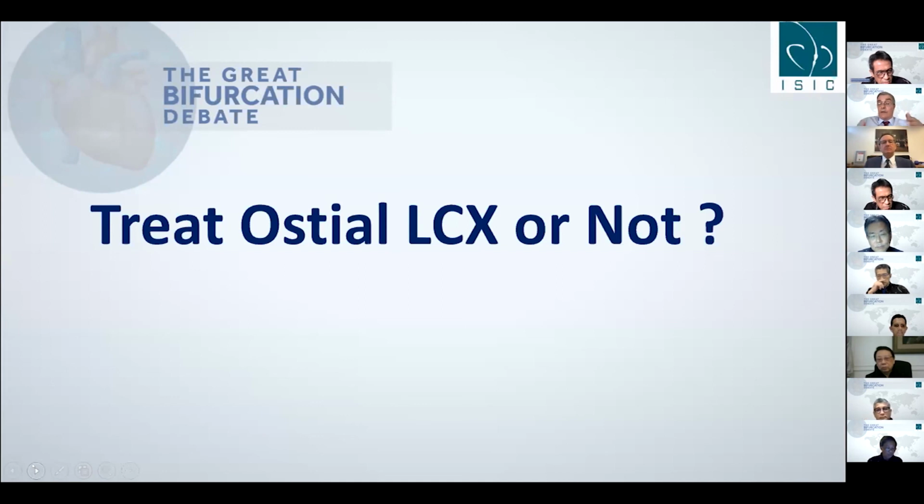So position the distal marker in front of the carina, in the angiographic projection in which we most widely open the bifurcation angle, and in this case should be LAO caudal. This is what I would do.